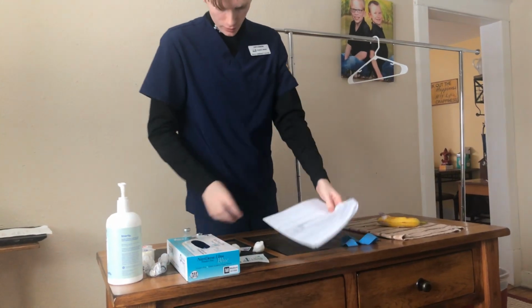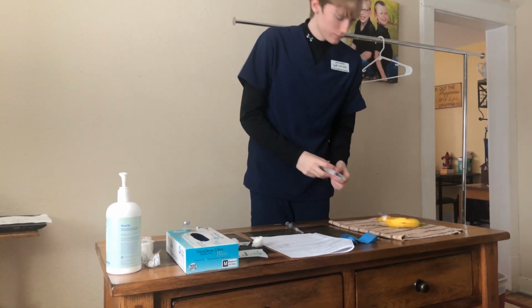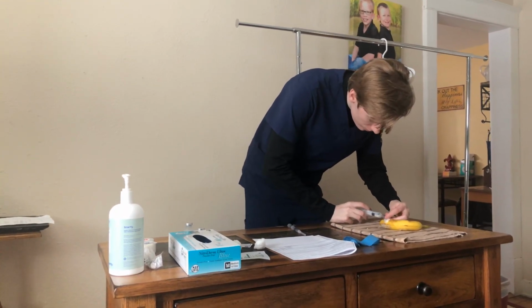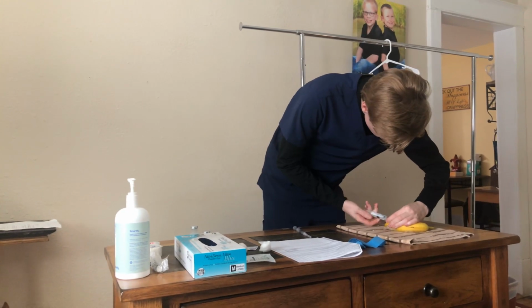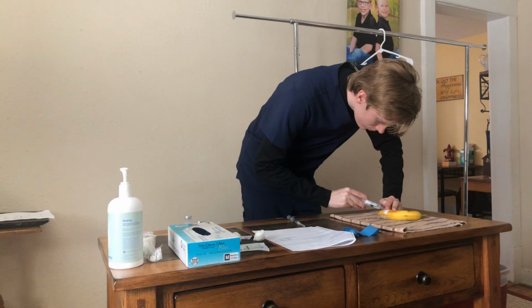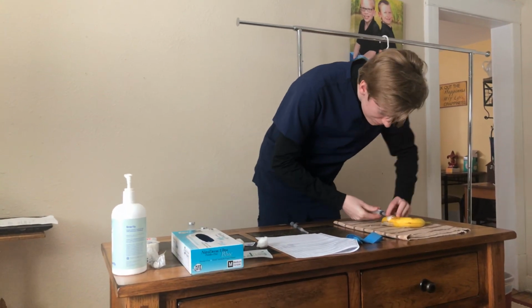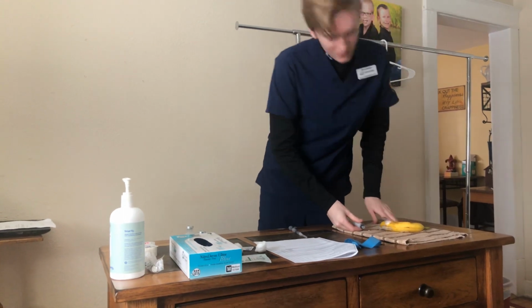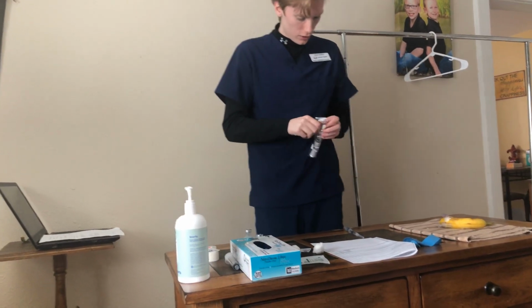Now before we start, I'm going to flush with 5 mils. Now that we have flushed with 5 mils, I'm good to inject the medication.